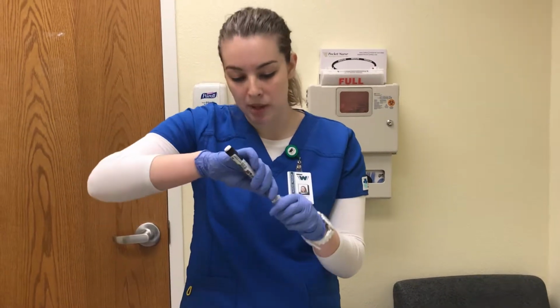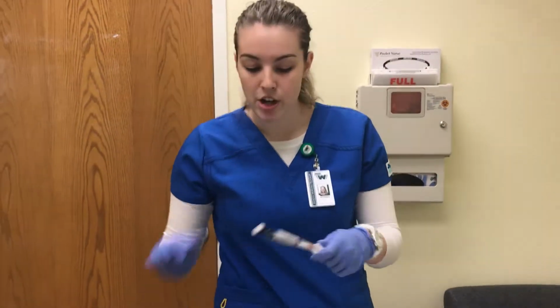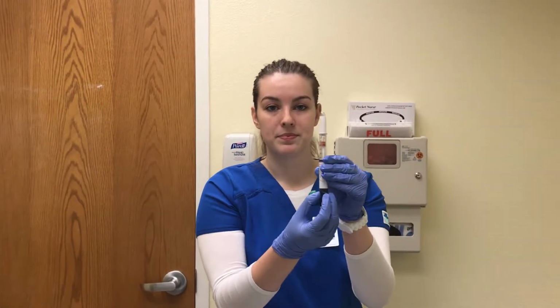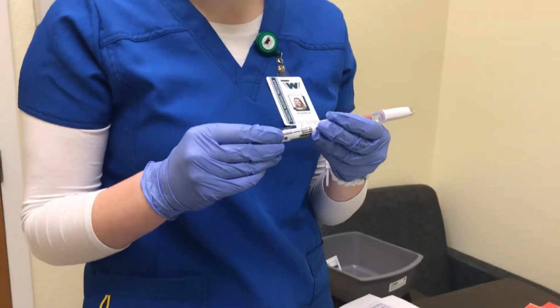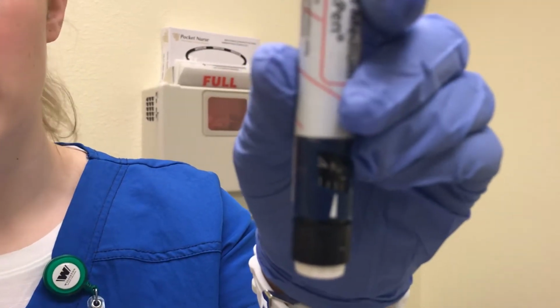And I will just take off this plastic cap, but I will put it back on to keep my needle sterile, just so I can show you priming it to 2 units, which I need to do, and then I can set it to my 2 units again. So I have my 2 units primed. Okay, and then I will just push up until you see liquid. And you can see the liquid. So now I can set it to 2 units, and I will have my second nurse verify that, and another coworker. So it is verified to 2 units.